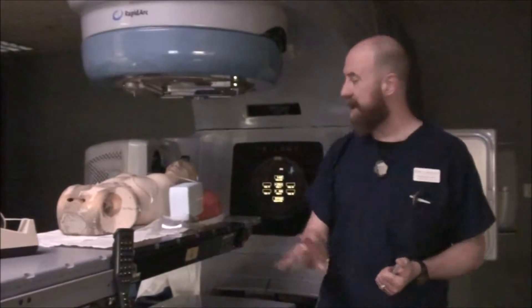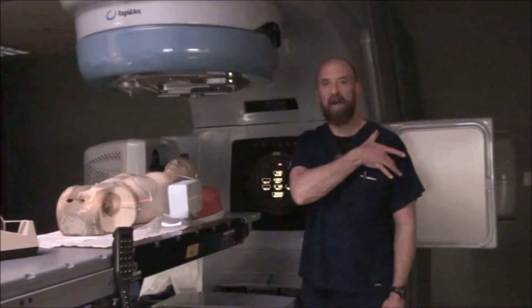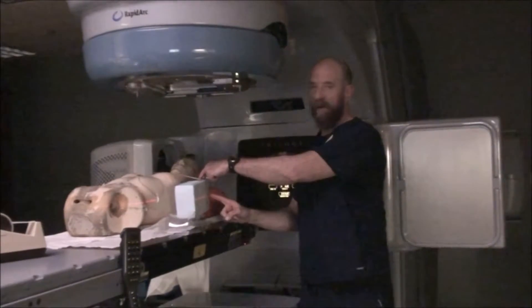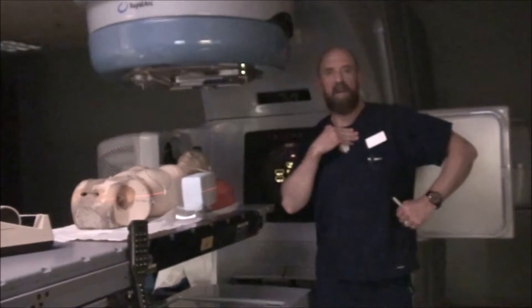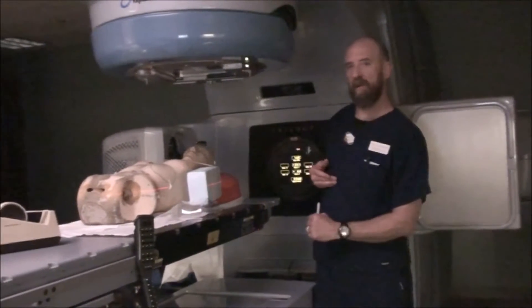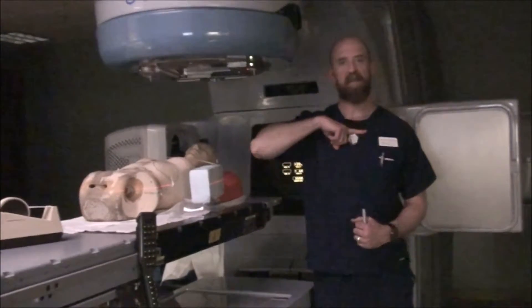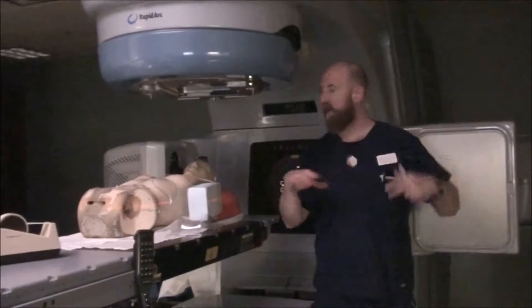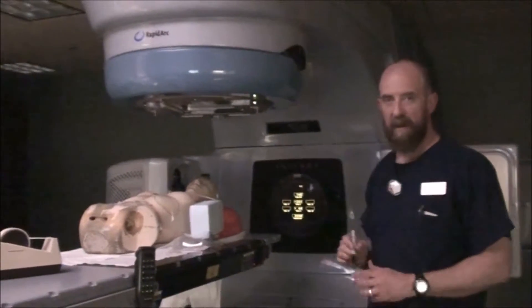The only time I do mark the lateral is if I'm up at the shoulder girdle. If you don't have enough room to put long marks, a lot of times you'll end up with a mark on the chest, a mark at the CR, and a mark lateral so that you can get the entire shoulder set correctly. Because you can have the shoulder kicked way out and the field will be out of range, or too close to the body but the CR will still look fine. With marks on the chest, at the CR, and lateral, you'll be able to get all three working parts in line.